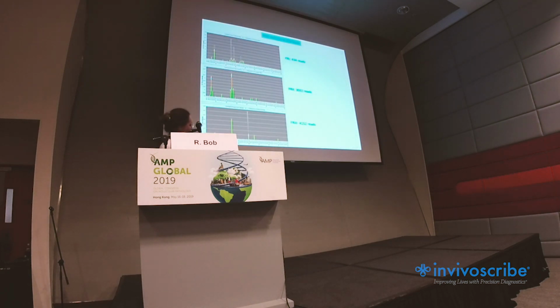And we applied a fragment analysis. You see that you have a dominant peak here in framework 1, but when you look at the number of reads, it is for clonality analysis quite low. And then we look at framework 2, we have a sort of oligoclonal pattern. Again, the number of reads is low. We need a cutoff of 10,000 reads for each tube, actually, for each reaction.